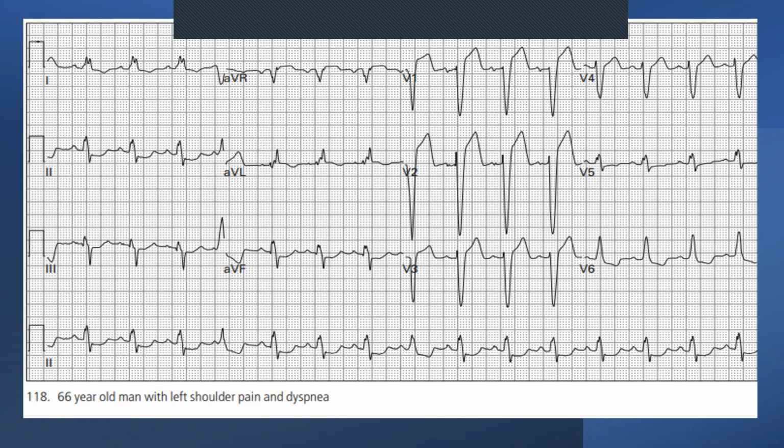As compared to a patient who's come in completely asymptomatic, coming for a routine checkup, has had this many times before, you've got a history of left bundle branch block, and now you see another one coming out, and you compare it to an old ECG and it looks the same. That tells you that, listen, this is not a new event, this is an old event. So that's the basic thing that we're trying to determine. Is this an acute event or is it not an acute event?